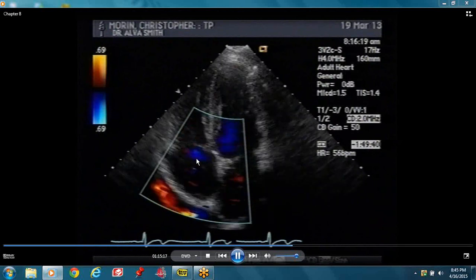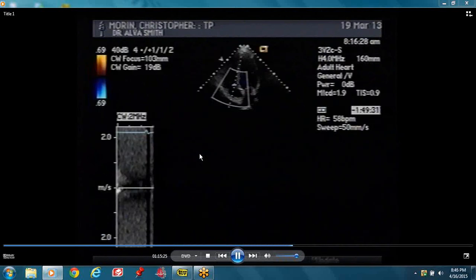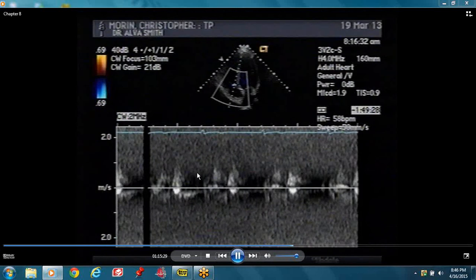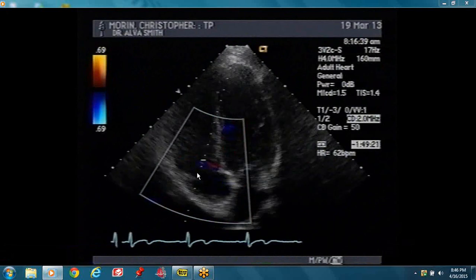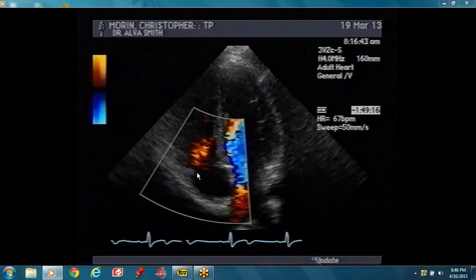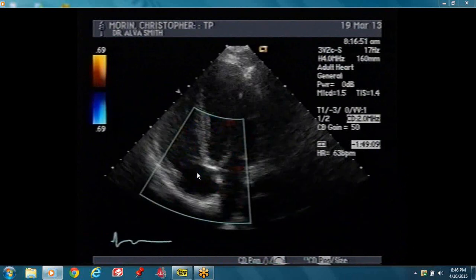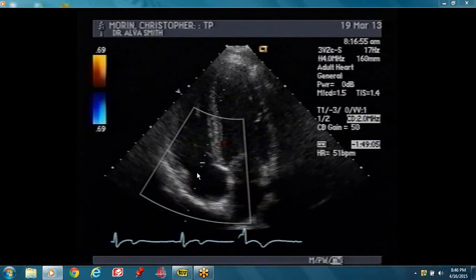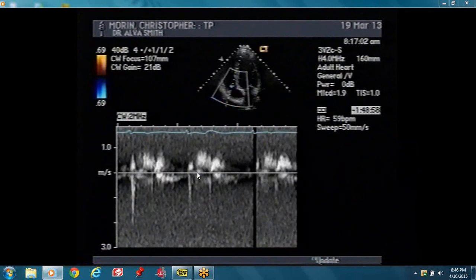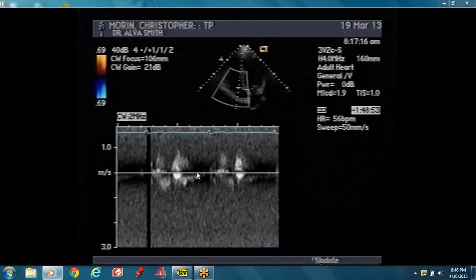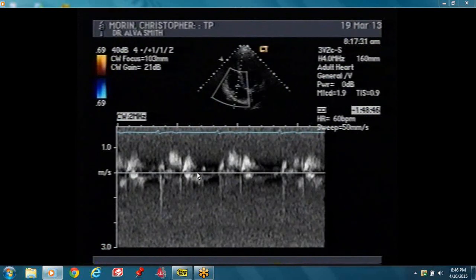There's a little bit of tricuspid regurgitation — physiologic of course. You put your cursor across the tricuspid valve and assess the tricuspid inflow, evaluating if there's any significant TR. We're going to be doing the right heart evaluation separately. There's no significant TR there.